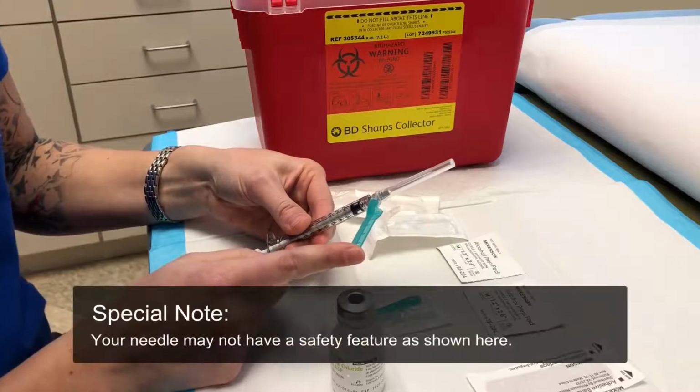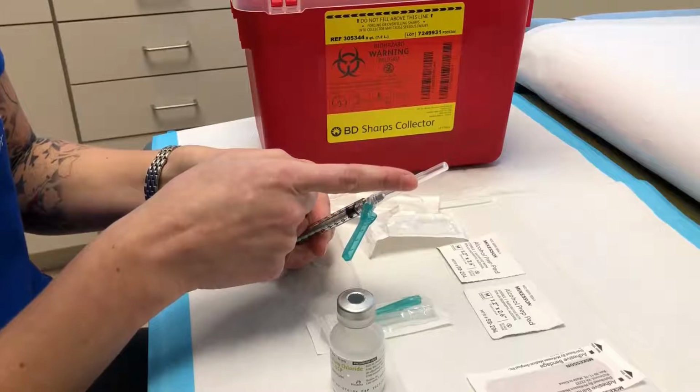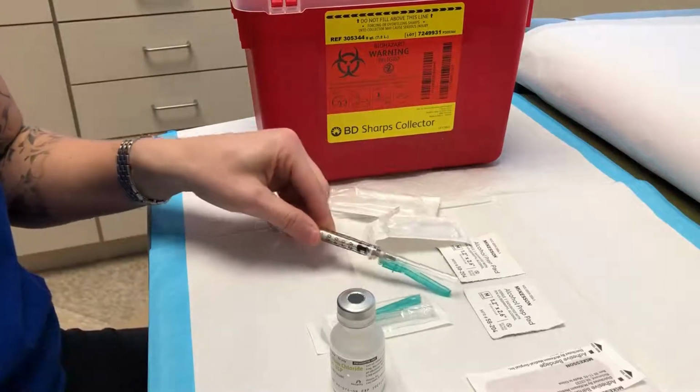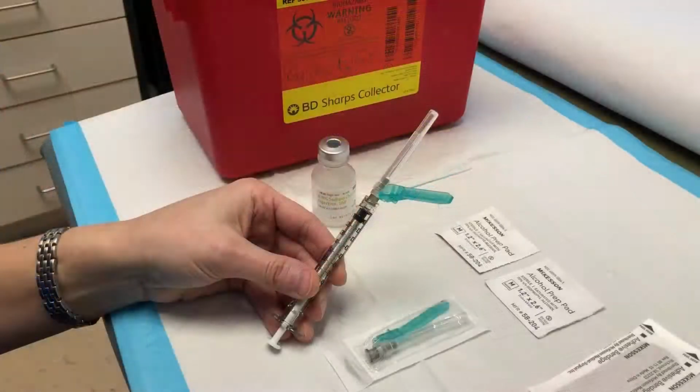This feature is here so that when you're done using this needle, instead of putting on this plastic top and accidentally poking yourself, you'll simply push down on a flat surface until you hear it click, securely closing your needle.